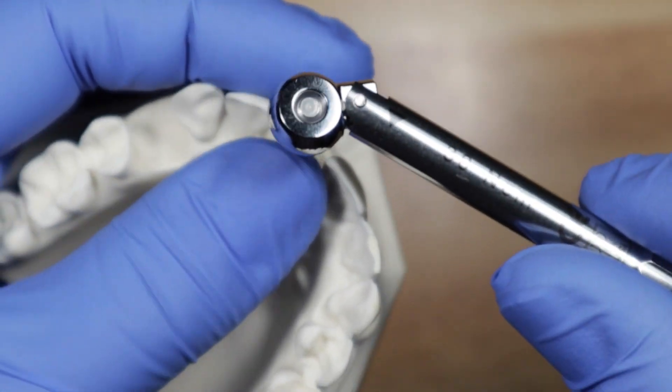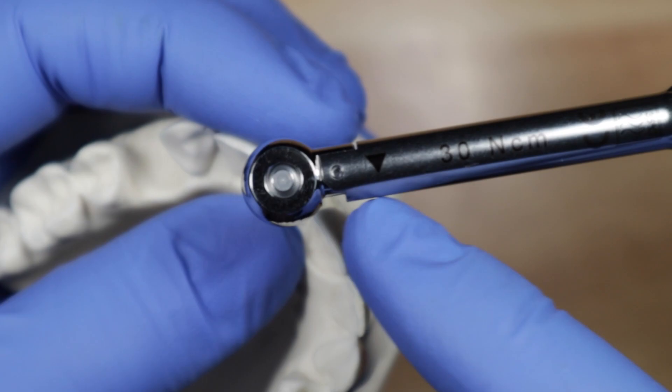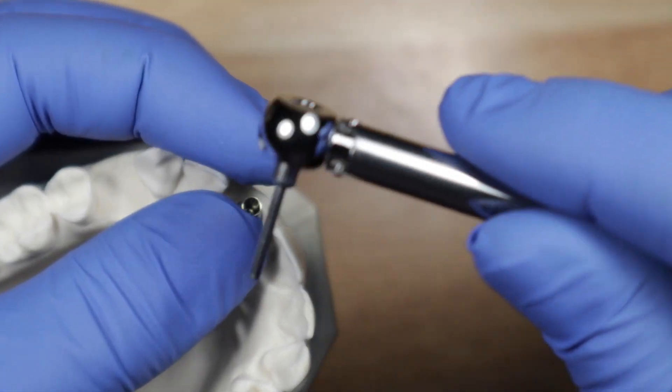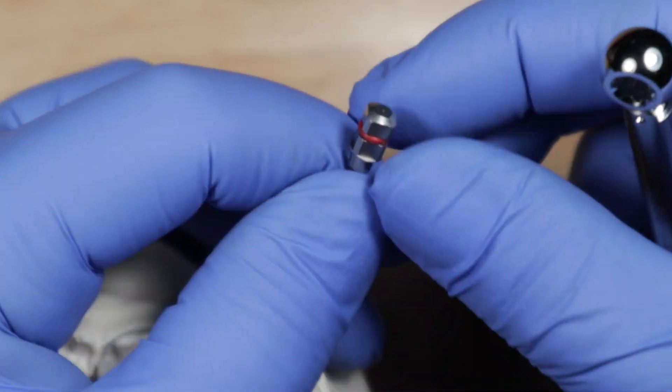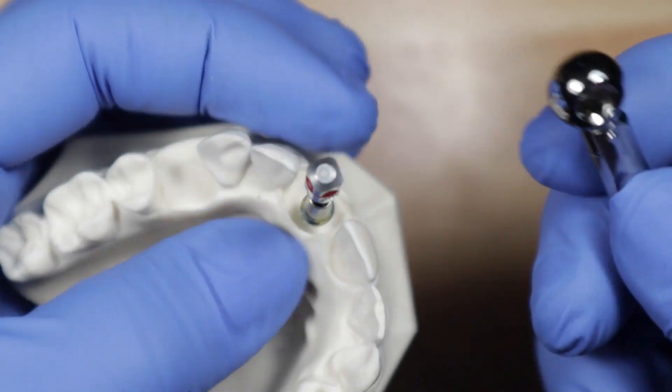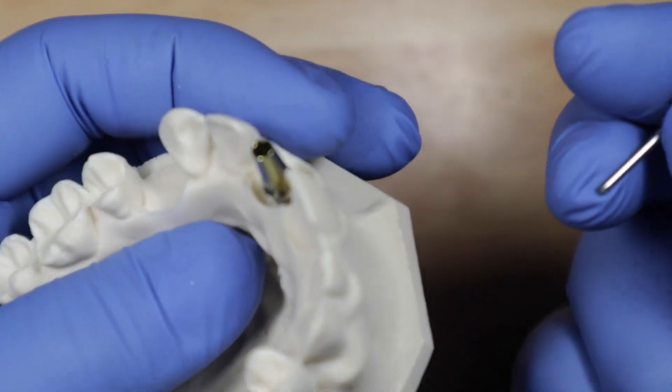You actually can't over torque it here and then you know that your prosthetic abutment is already torqued to the level it needs to be. So then you just pull this off. This comes off together or sometimes because it's two pieces, sometimes it might come off like that and then you just pull it off. Okay. No problem.